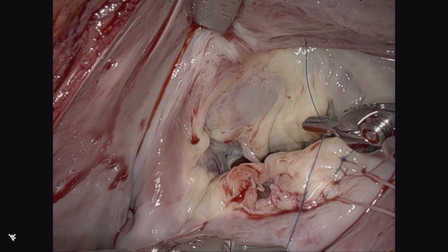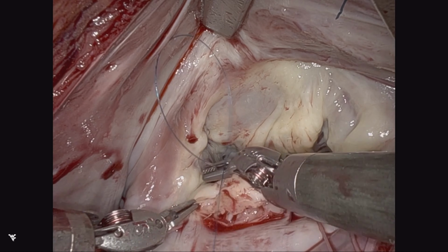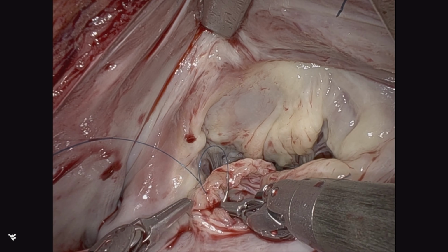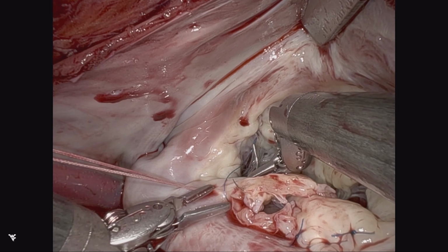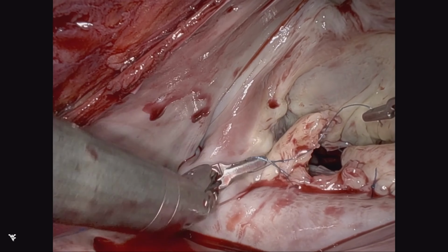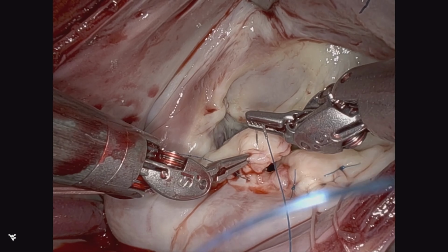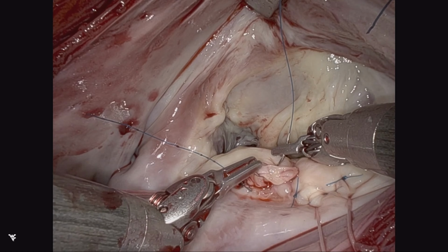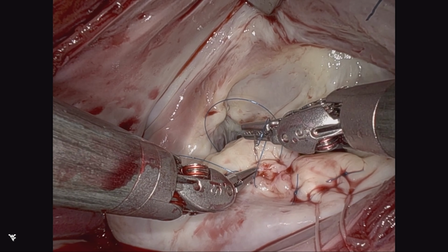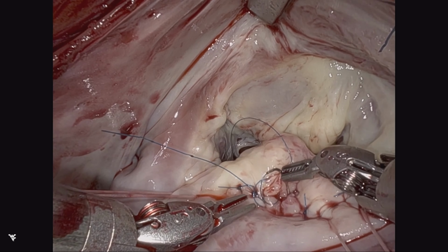Now, this can appear daunting, but the truth is, as long as we follow the anatomy and follow lesion-specific therapy, and you're building upon your skill set, this is something that's very doable. With good restoration, somewhat plastic surgery of the mitral valve per se. As long as there's not tension, one can project durability.